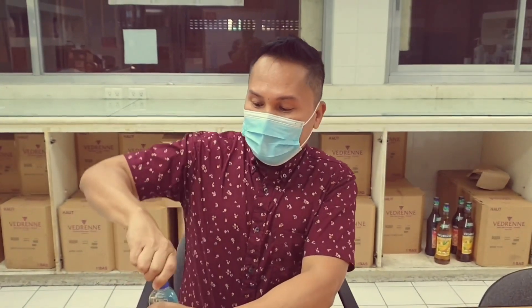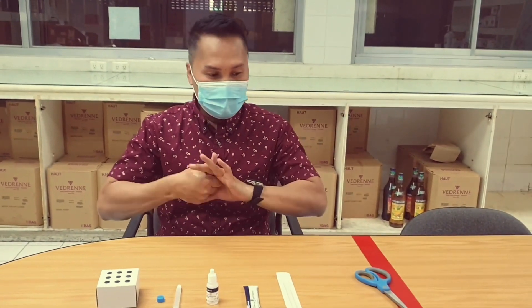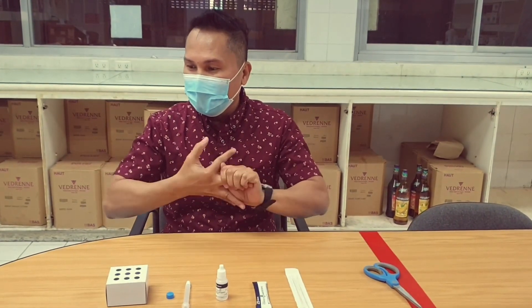Now we are ready to start. Make sure to sanitize your hands first and use the proper hand sanitizing technique. When you use an alcohol, make sure that it is at least 70 percent — either ethyl or isopropyl, it doesn't matter.